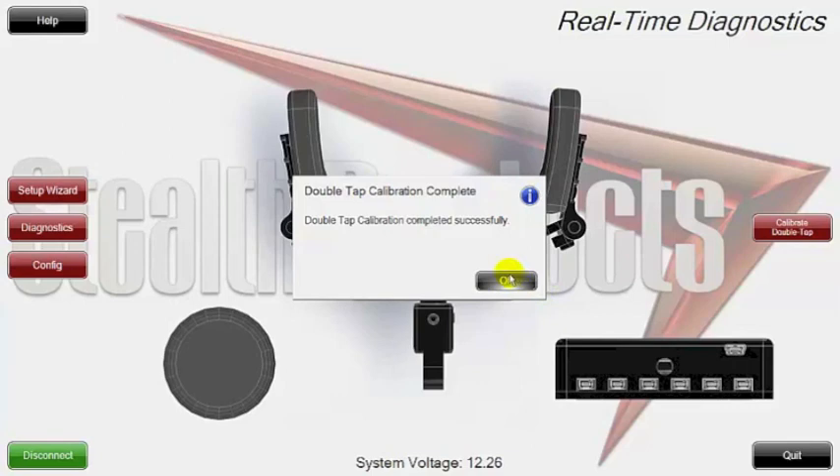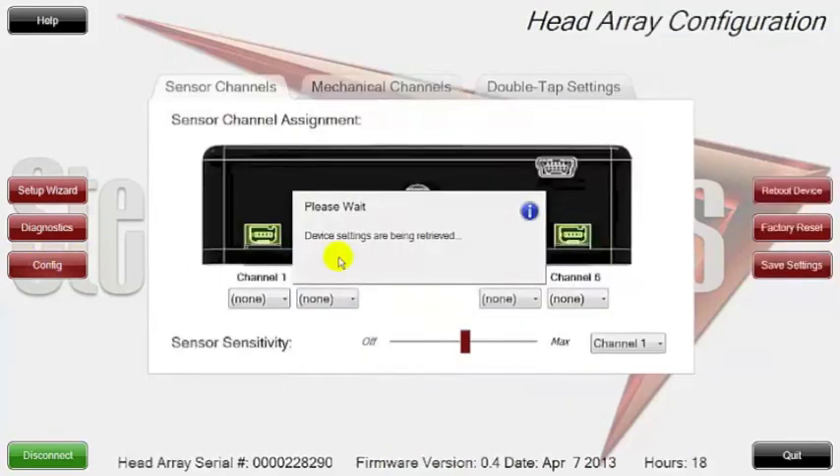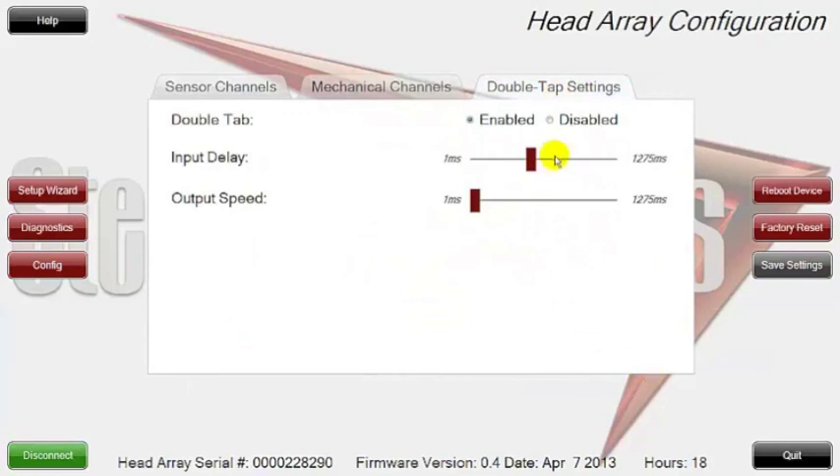We're going to go back into configuration now and look at how it changed the settings. You can see it came a little bit past below where it was at the 50% point that we started at, and the output speed went way below because I clicked it fairly fast. This shows you that you can calibrate this with a client — just asking them to do a double click — or you can do it manually if you want. It's just another intuitive way of programming your reset mode change switch.